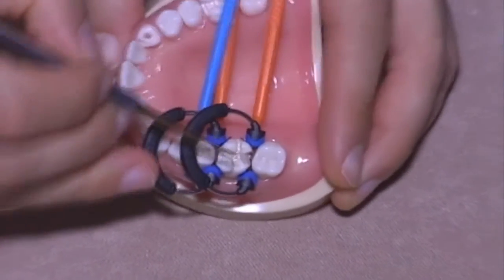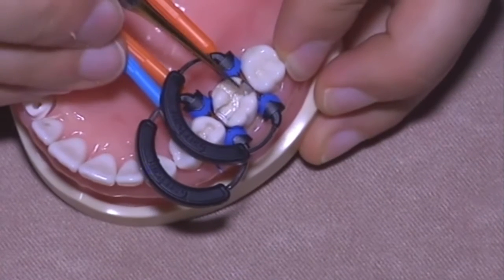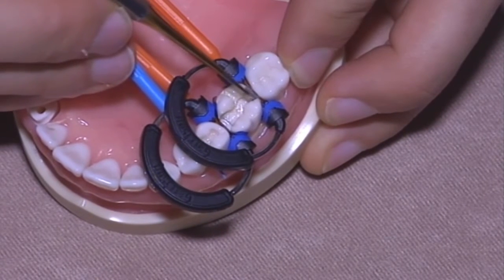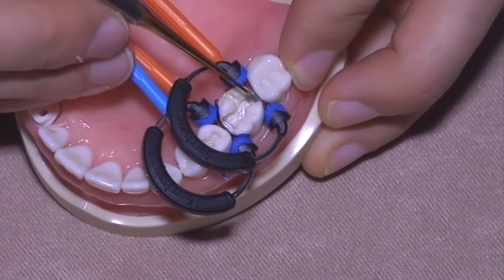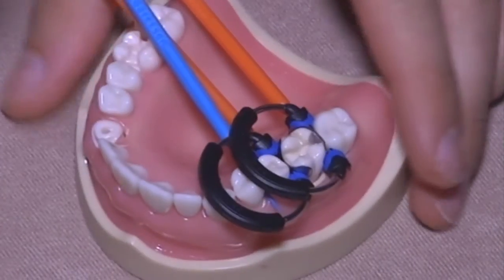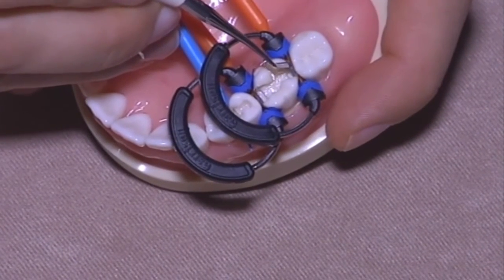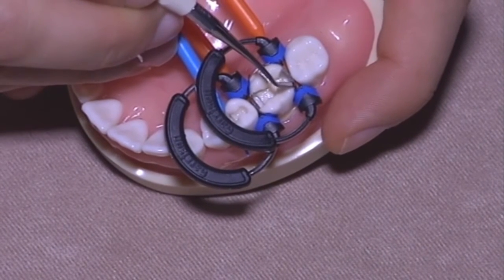The procedure is exactly the same, so I move faster than before. You must be gentle in touching the composite in order to let the composite adapt to the cavity.